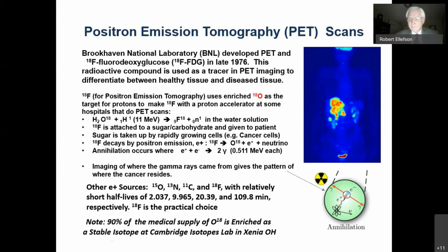What we're showing over to the right is an image that's rotating. On the background CT scan image, there are colorized regions where there are different levels of concentration of the PET scan signals coming, and that would directly relate to the amount of cancer that is there. I mean, this is the assumption.